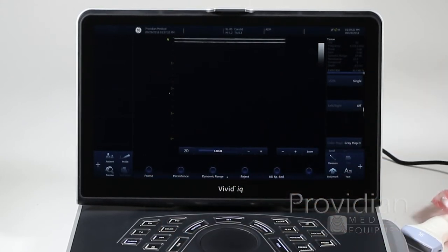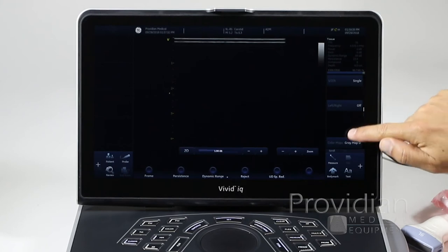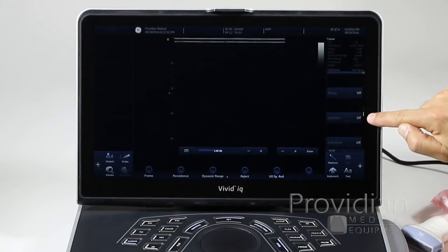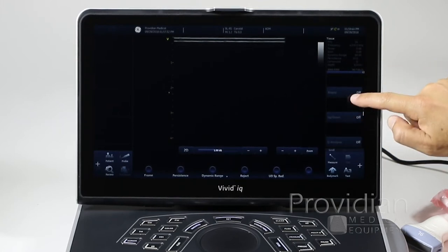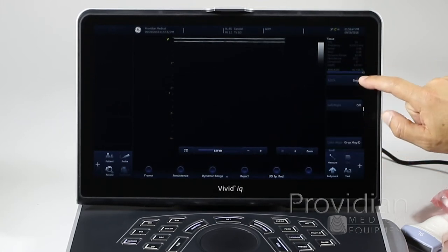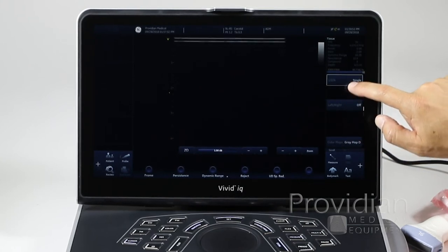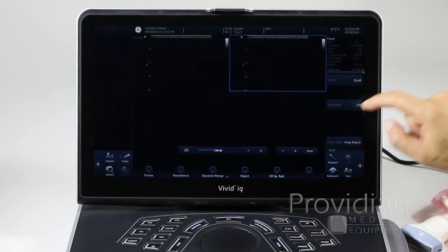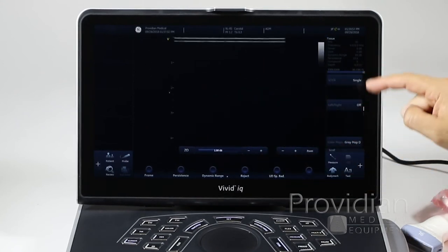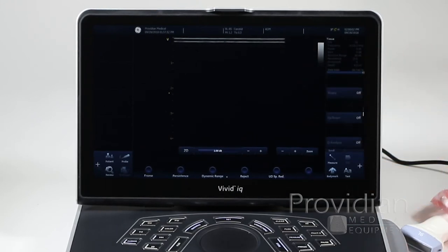Since it's touchscreen-driven, you'll notice a little dot at the bottom and two lines at the top — one white, one dark — indicating you can scroll. Two lines means two pages to scroll through. You can tap the screen layout icons: one is single screen, and four is for multi-screen — dual and quad. You just keep tapping to flip between them, and we'll get to that in the scanning mode.